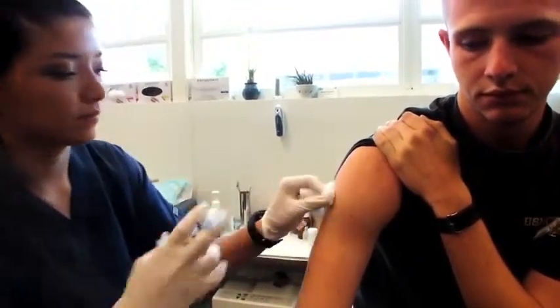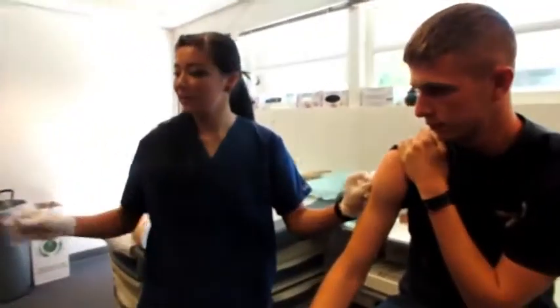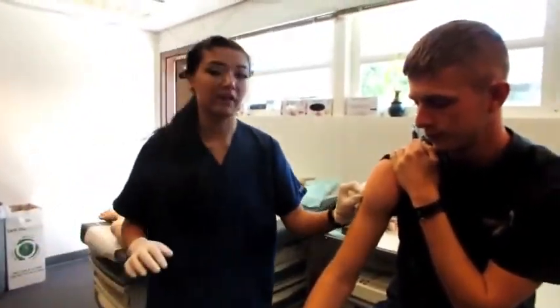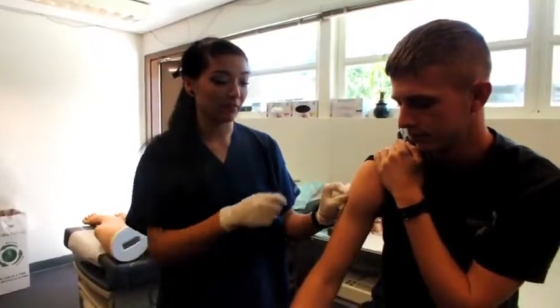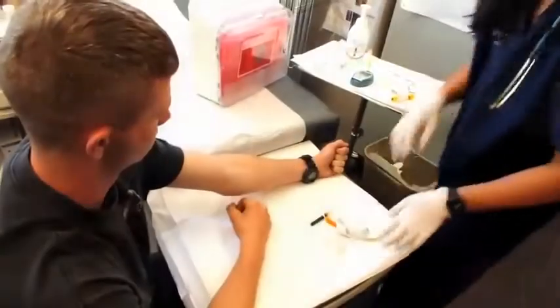Okay. Good. Lock the needle immediately. You aspirate the needle to make sure that you haven't hit a vein. And if you have aspirated blood into the needle, you throw the needle immediately away. Okay.